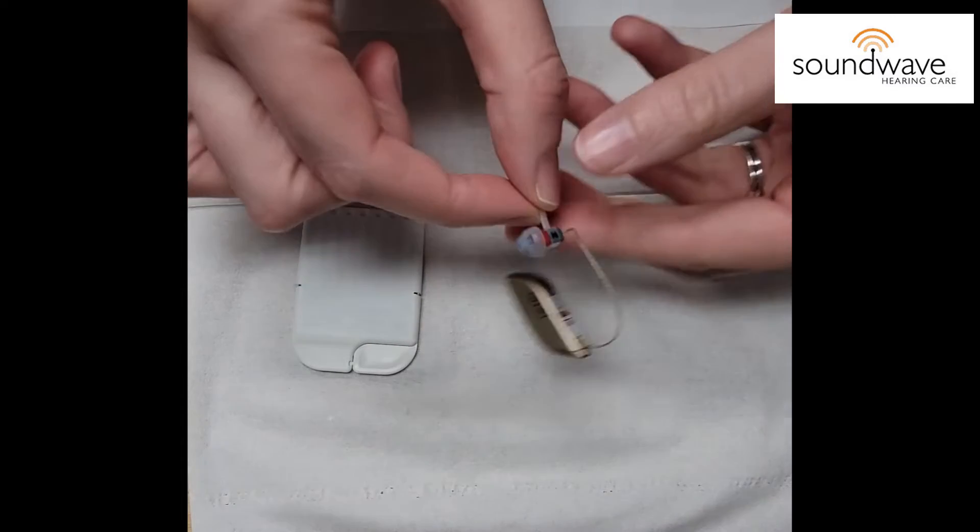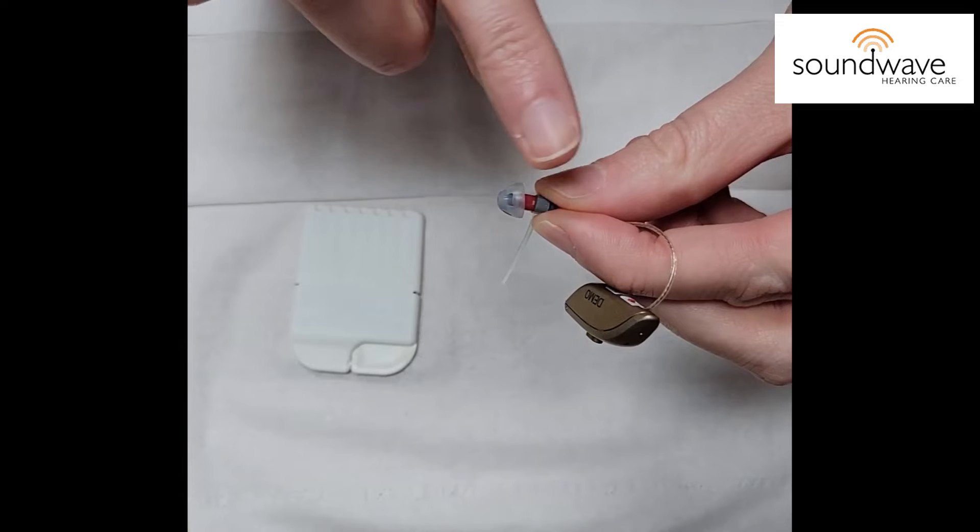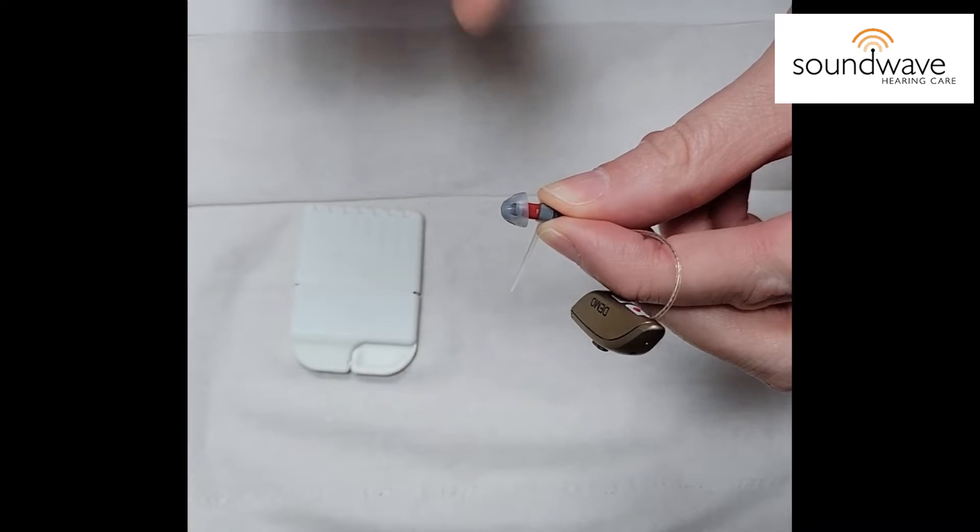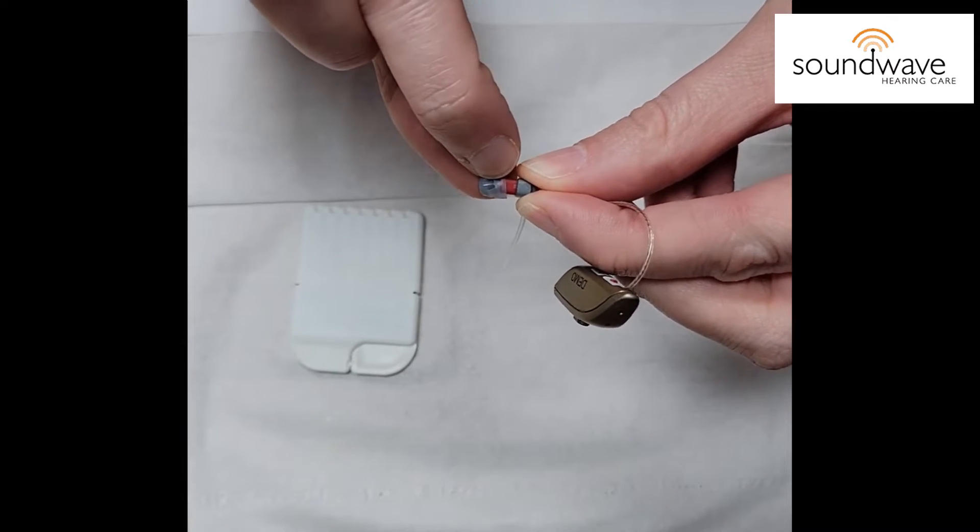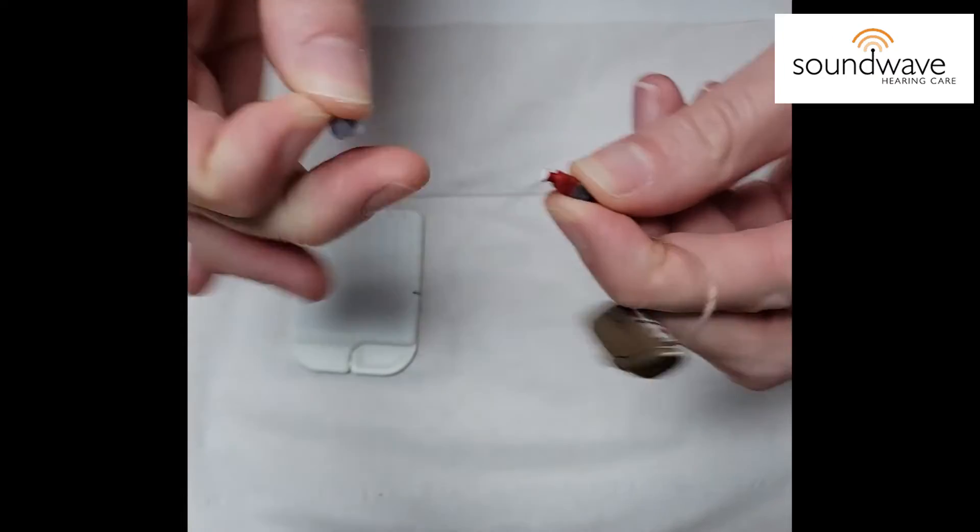What you need to do is you're going to grab your hearing aid and we need to remove this little silicone cap. To do that I recommend giving it a little pinch and pulling it off.